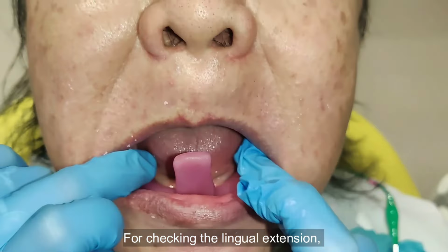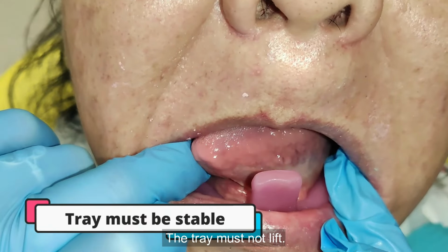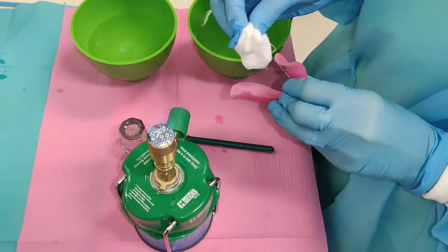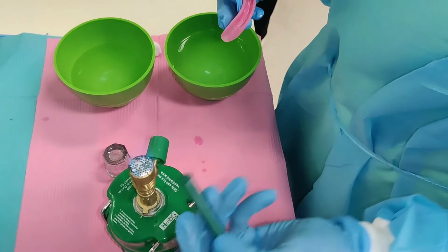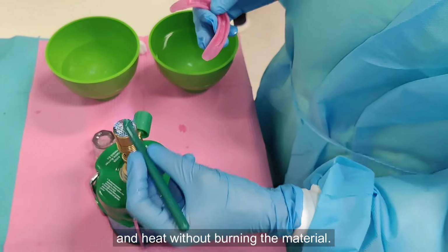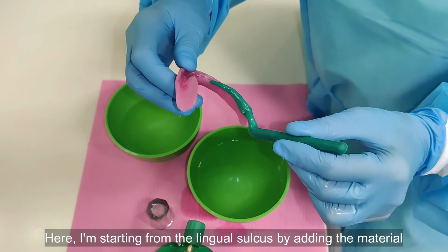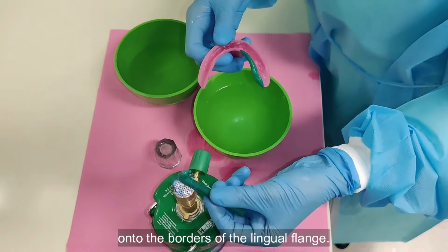For checking the lingual extension, ask the patient to move the tongue to the right and left. The tray must not lift. Ensure that the tray is dry before you add the material. Hold the green stick compound in a pen grip and heat without burning the material. You could start the mandibular border molding either by adding the material on the buccal or the lingual aspect. Here, I am starting from the lingual sulcus by adding the material onto the borders of the lingual flange.